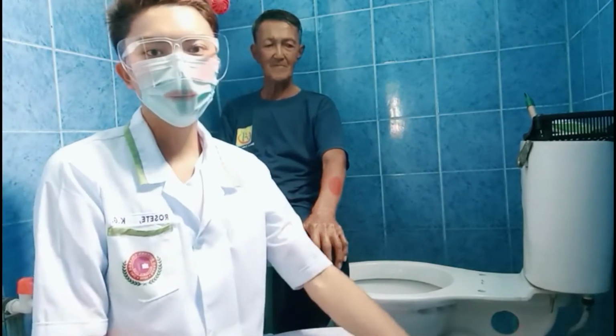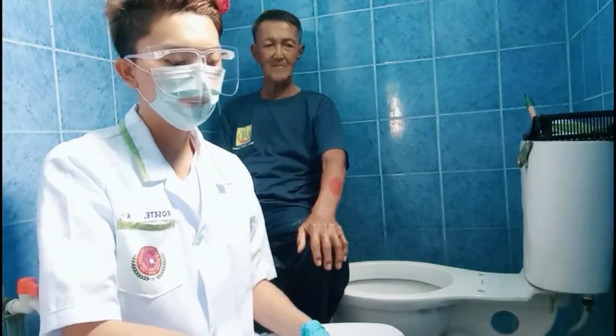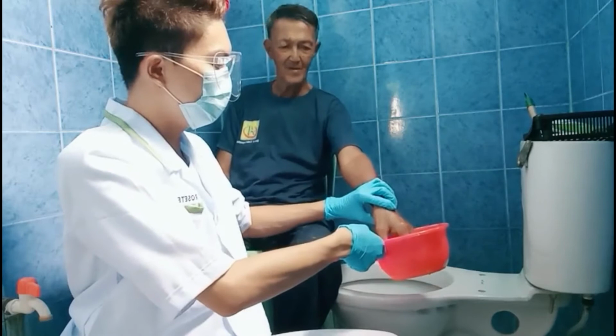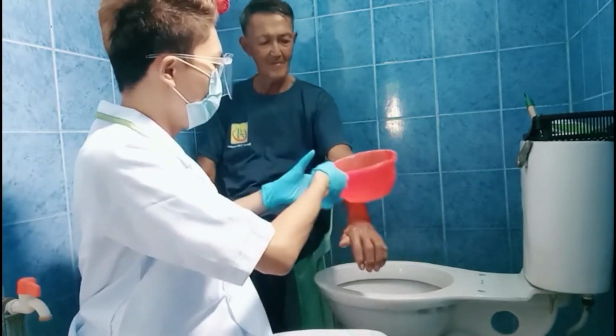Now I'll begin. First, you must check the temperature if it's warm or not. Sir, pakipaliw po sir. Okay lang sir? Okay lang. Sige. Now I'll begin irrigating or showering the wound.